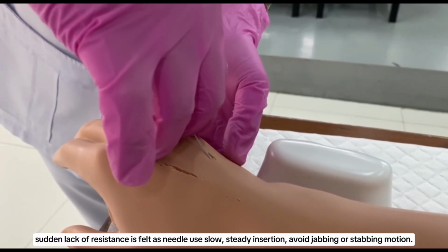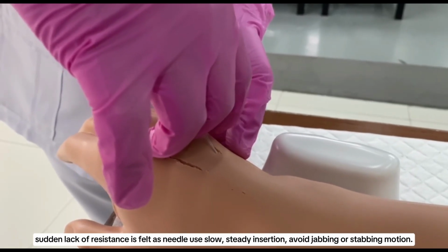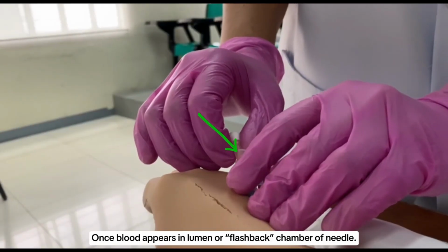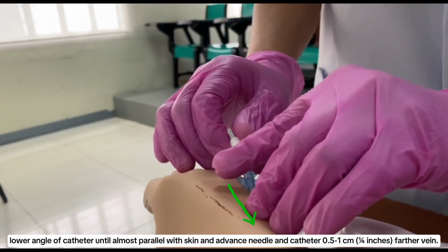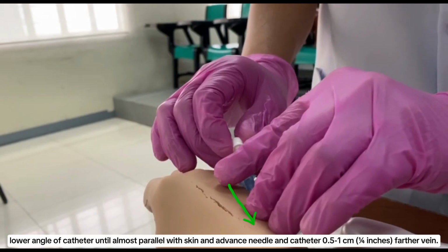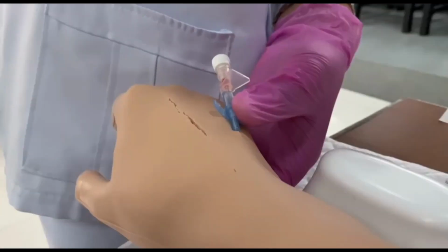A sudden lack of resistance is felt as the needle enters the vein. Use slow, steady insertion, avoiding a jabbing or stabbing motion. Once blood appears in the lumen or flashback chamber of the needle, lower the angle of the catheter until almost parallel with the skin, and advance the needle and catheter 0.5 to 1 centimeter or 1/4 inch farther into the vein.